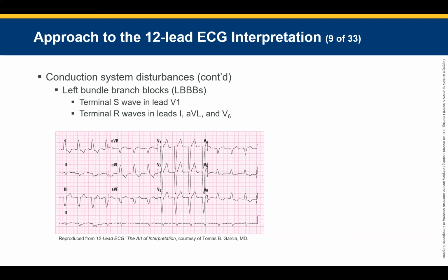That is exactly what I'd say. Patient's in normal sinus rhythm, rate of 75, he's got a left bundle branch block. If I'm going to a cardiac center, now I'm really looking at my patient. Mr. Smith is looking sick. Right? Mr. Smith's looking sick. He's looking like he's having a heart attack.